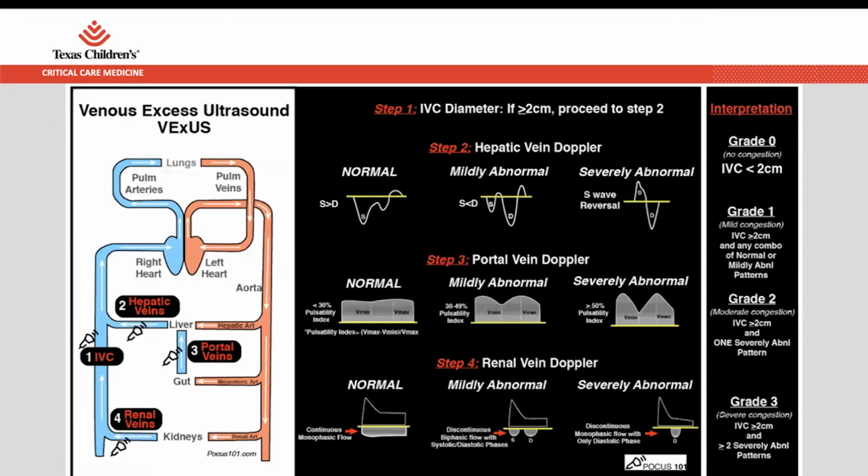There are a number of tools out there that you can easily download and keep on your phone just to be able to reference to try to scale what VExUS is. And we have various grades that are used from the original paper to try to characterize severity. Ultimately, outcomes are going to be dependent on population, and that wasn't something that was explored as much in the previous paper, though the grades were primarily used for scaling of how severe the overall illness was. But there are a number of tools out there. They're all pretty useful for just being able to get some comparison images out there.